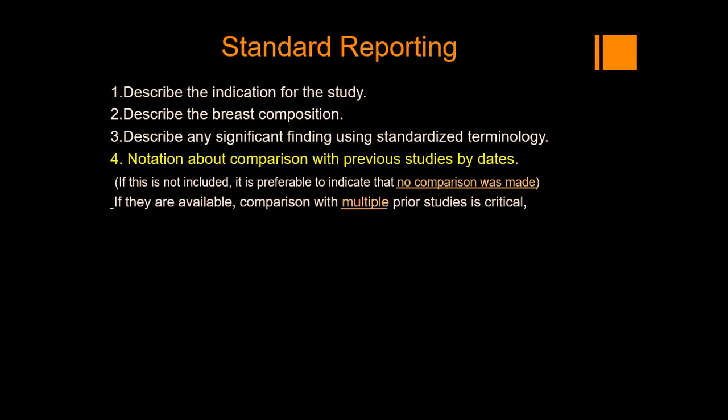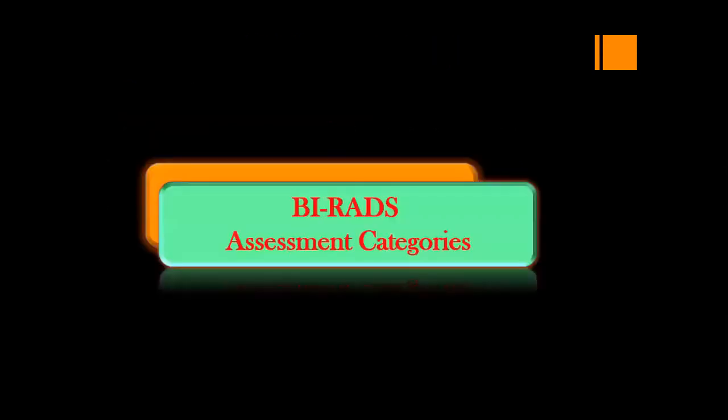Or sometimes the difference in size of a lesion cannot be appreciated since last year, but when you compare it with the previous many years back, you might notice the difference.